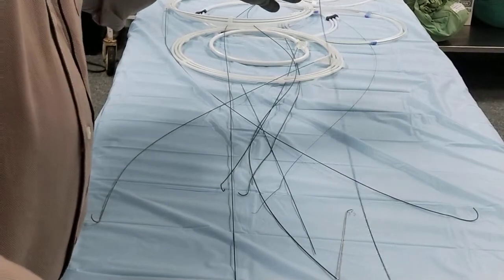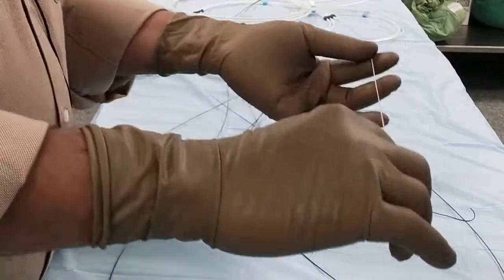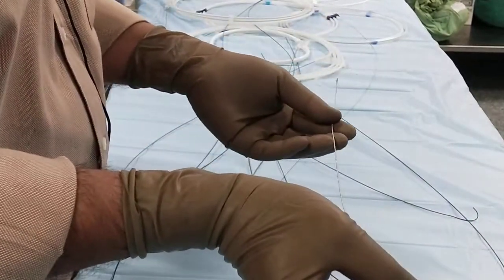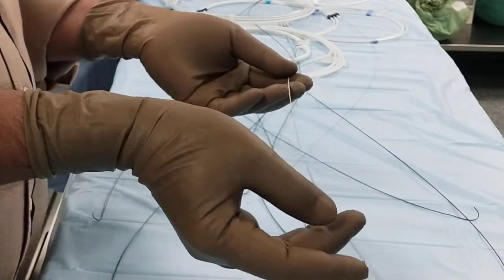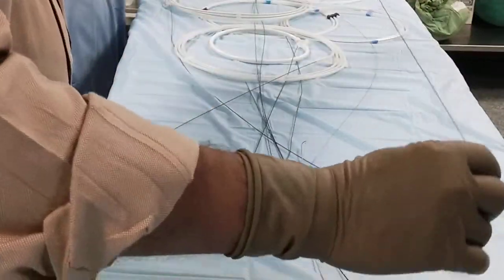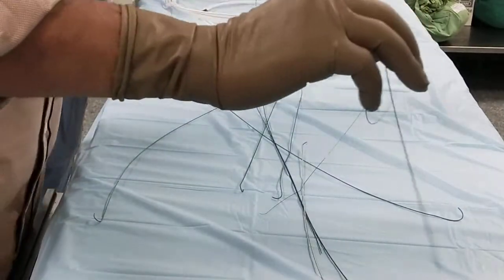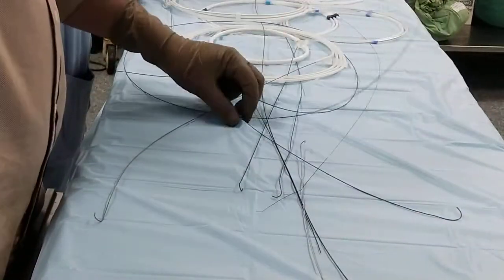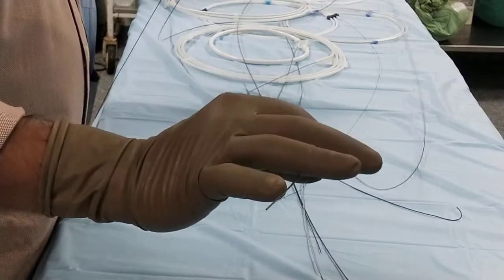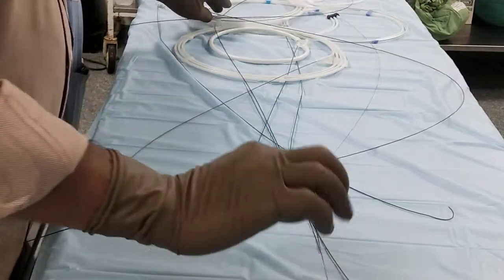When we are introducing the sheath, we need a shorter guide wire — always take a shorter guide wire. It is very easy to handle. If you use a long guide wire, it takes longer, it can fall, cause contamination, and may get kinked. So when having initial access, always go for a shorter guide wire.